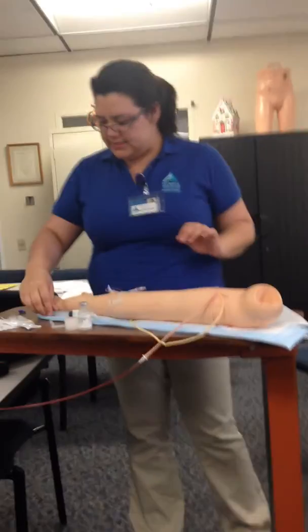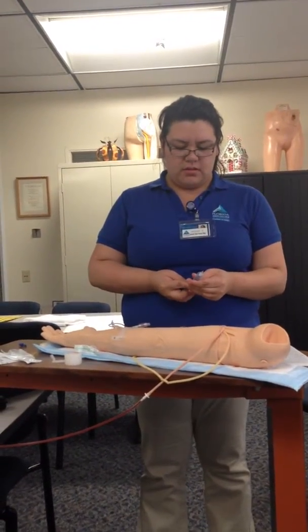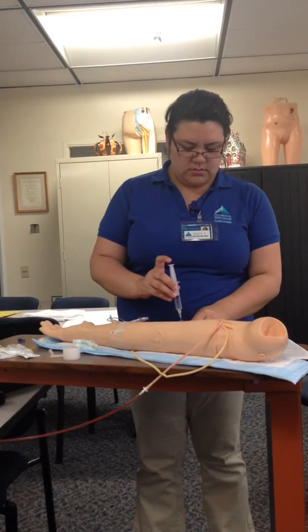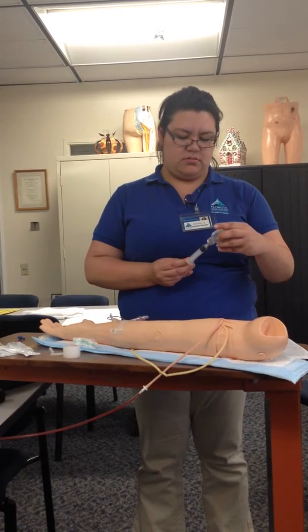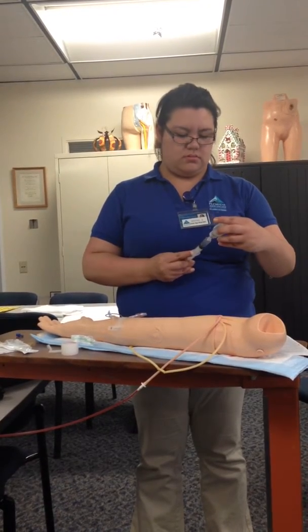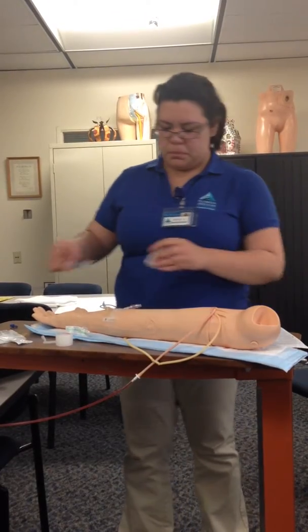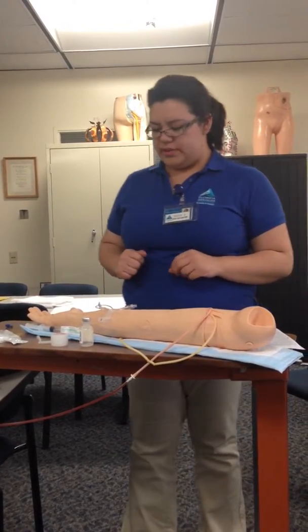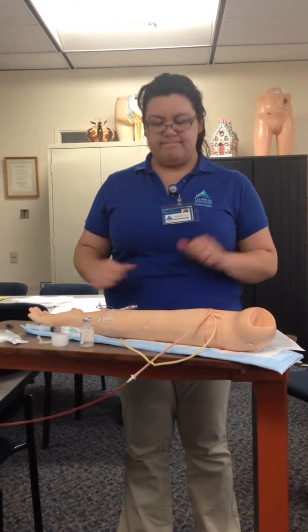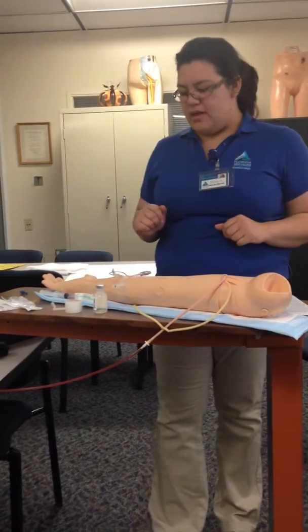Now I'm going to draw up 6 mLs of saline. And so now I'm going to walk into the room.